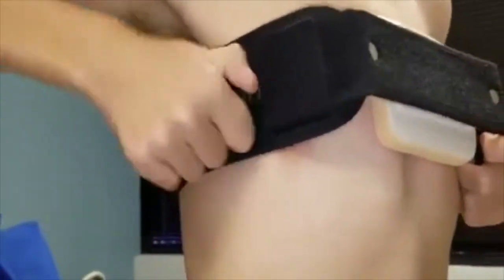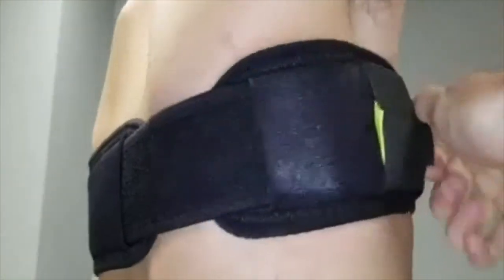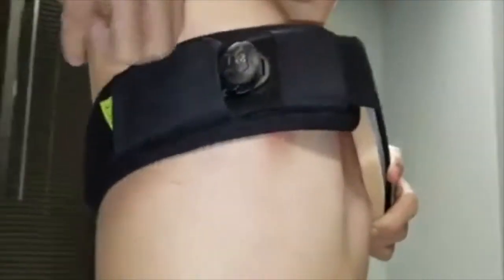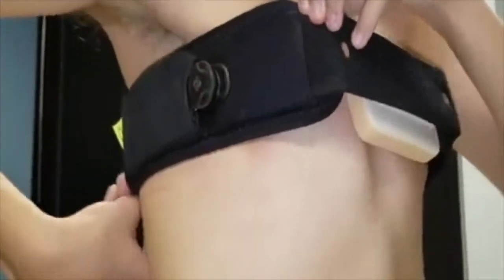The closure also functions to precisely fine-tune the amount of pressure being applied to the affected site by shortening or expanding the connected straps with ease. We designed this brace specifically to increase patient comfort and therefore overall extended wear time.